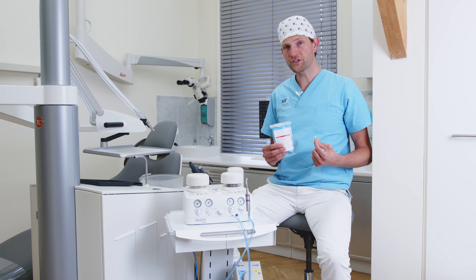It can be used both on the silver and gold handpiece, and it's very easy to reapply after every patient.